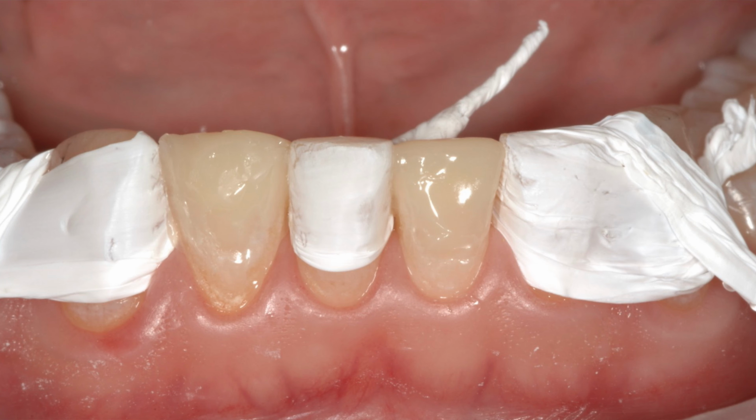And for case one from the webinar, the lower arch, I did additive bonding to the lower incisors. So I built up the lower incisors based on the wax up from the mounted study models using just direct composite. And that could have been left for a number of years, I believe, because they look pretty good and they were designed in the proper occlusion and everything was good.